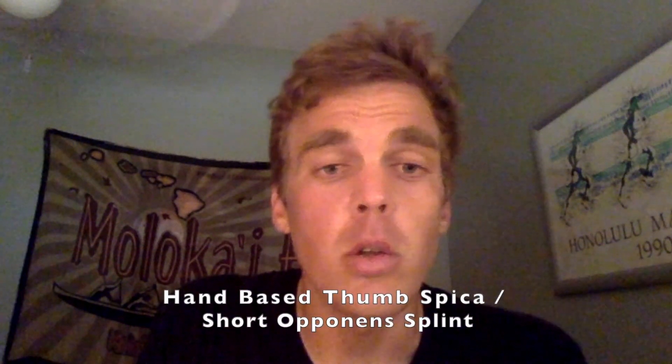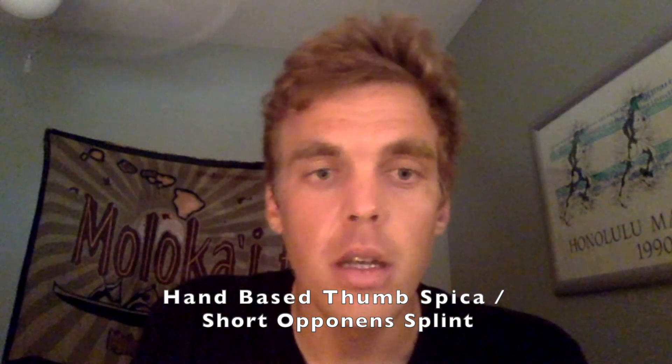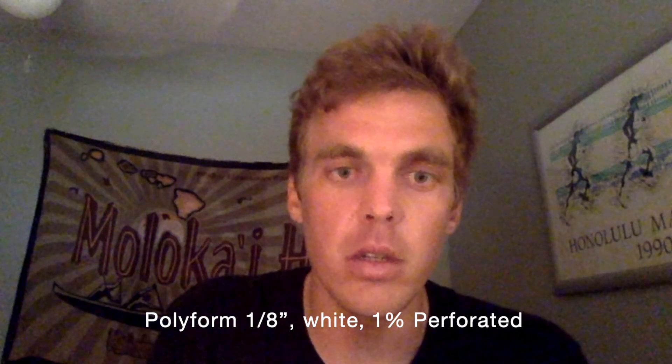Today we're going to be making the hand-based thumb spica splint, also known as the short opponens orthotic or splint. We're going to be making this with 1/8 inch polyform white, 1% perforated, like we usually use here.